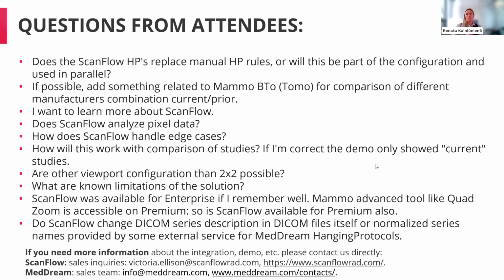Okay, so I can read the next one. We got a question during the webinar. I'm going to read it now. How will this work with comparison of studies? If I'm correct, the demo only showed current studies. This will 100% work with comparison studies. That is the whole point of ScanFlow. We want to make sure that all the sequences are exactly where they should be, and all the comparison studies are where they should be as well. And doing the comparison studies along with MedDream, we'll be able to have all those comparisons exactly where the radiologist wants them every single time.